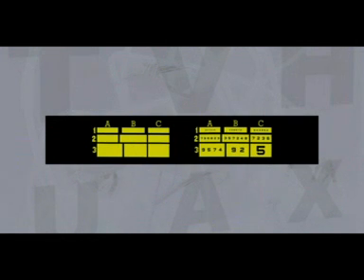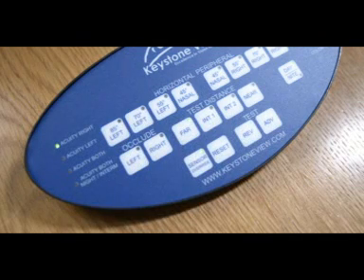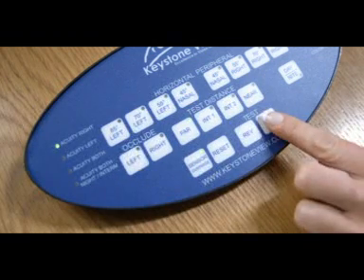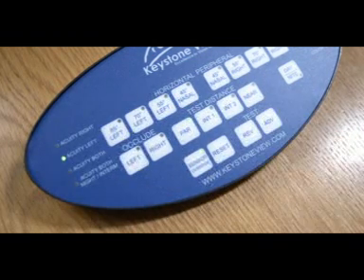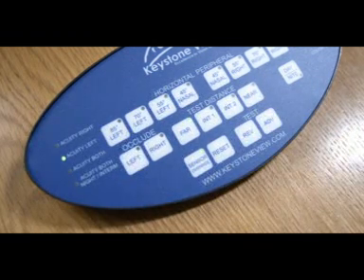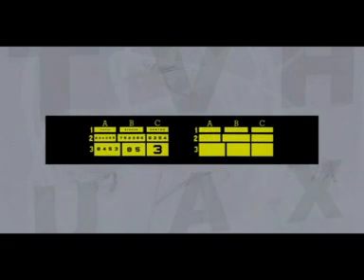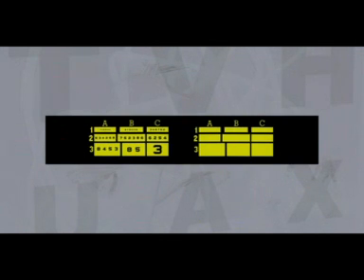Steve has now got only one digit wrong and can stop this test here. Now press the advance key marked ADV on your control panel to move on to test F2. This test measures left eye acuity.